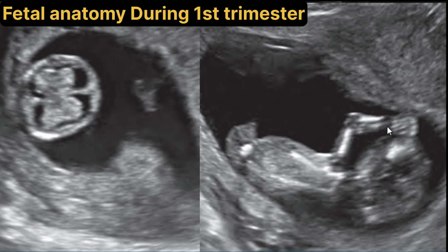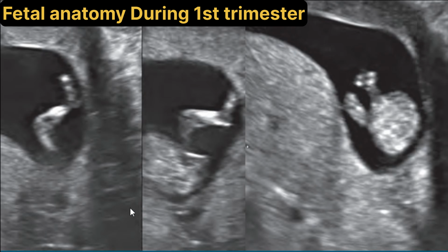Now this is the longitudinal image of the fetus. It shows the upper arm. Here we can see this is the upper arm. These are the radius and the ulna, and here you can see the hand of the fetus which shows multiple digits. And now here we can see the legs of the fetus which is placed side by side.